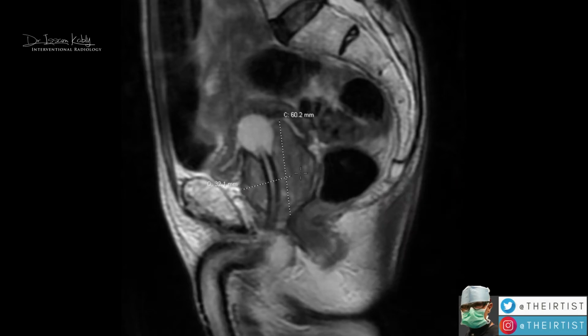The artery of the prostate usually has two branches, one that goes into the medial lobe, one that stays in the periphery. We're not really interested in the peripheral one. We only try to target the central one, the one that gives problems, because the peripheral one is not relevant for what we do. And second, it has more chance to communicate with other organs such as the rectum or the bladder, etc.